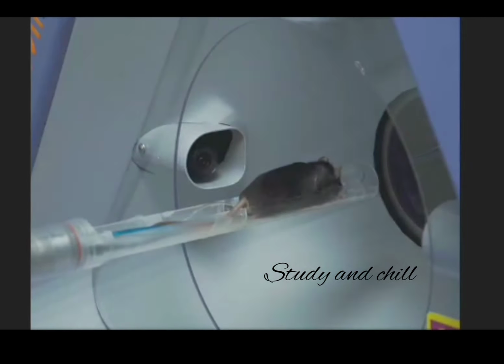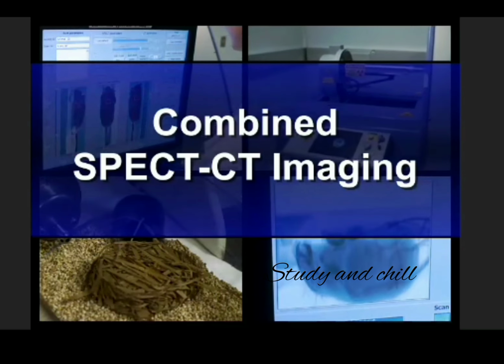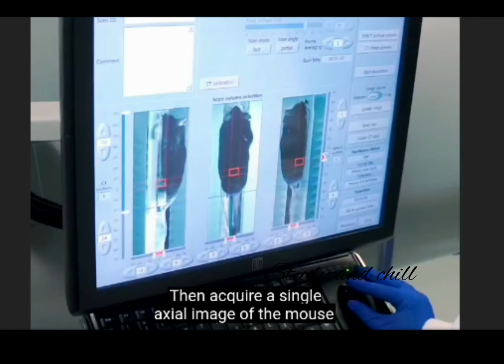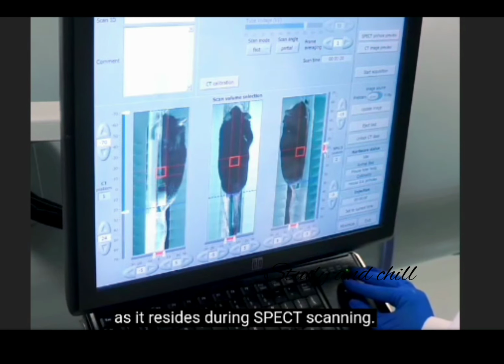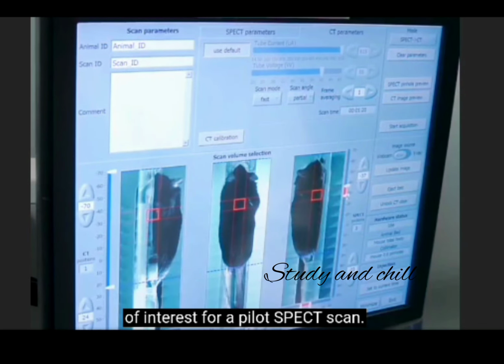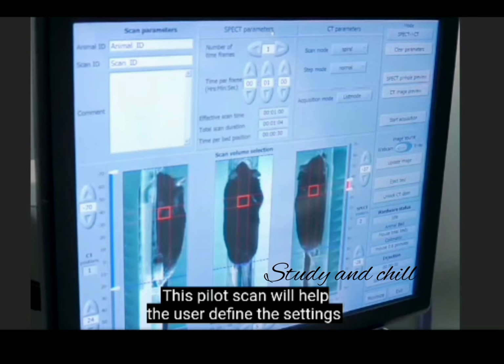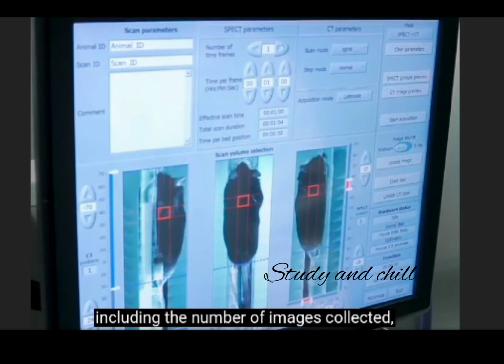Next, slide the mouse bed inside the collimator. Then acquire a single axial image of the mouse as a reference to determine animal placement as it resides during SPECT scanning. Using this as a reference image, set a region of interest for a pilot SPECT scan. This pilot scan will help the user define the settings for the experimental SPECT scan, including the number of images collected, the time per image, the scan mode or detector rotation path, and the step mode for improved image accuracy or increased imaging speed.